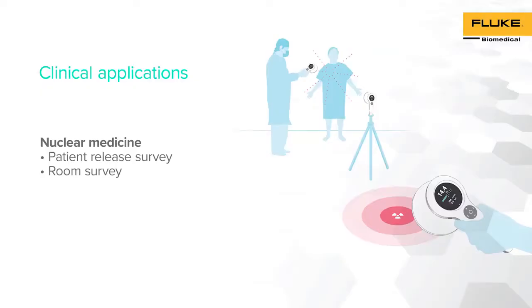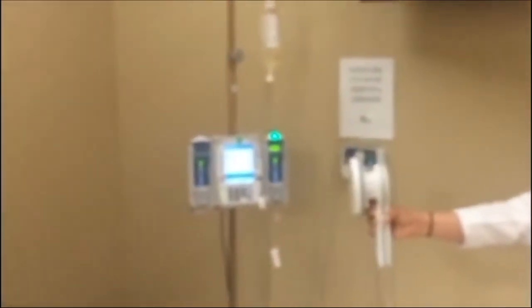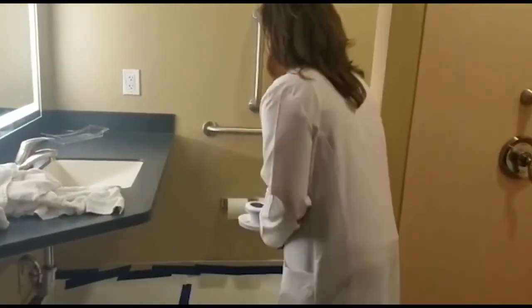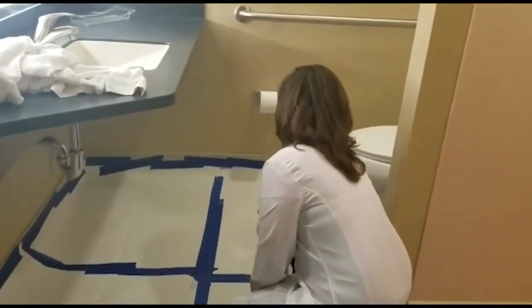RACE-A 452 has multiple applications in nuclear medicine. We will show how this versatile survey meter can be used for patient release surveys and room surveys. To perform a patient release survey, change RACE-A 452 into exposure mode by placing the gray lid into the instrument. After a few seconds, you're ready to start collecting measurements. Stand one meter away from the patient and place the effective point of measurement towards the patient. The patient meets the limit criteria and is ready to be released. To perform a room survey, just remove the lid and use the detector in Geiger-Mueller mode. Perform the survey and identify the area of contamination. Remember that the radiation limits and audio can be modified in the device settings.